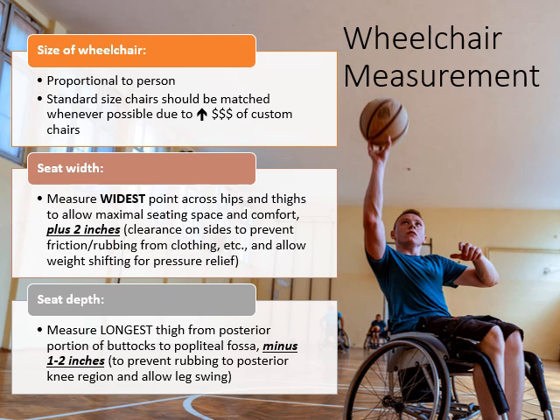For the seat depth, this is going to be a little bit tricky. We're going to measure the longest thigh. Okay, so our thighs aren't always equal in length. We're going to measure the longest thigh from the back, the posterior portion of the buttocks. Okay, so that's the back side that's going to come into contact with the back of the seat, all the way to the popliteal fossa. So that is the back of the knee.